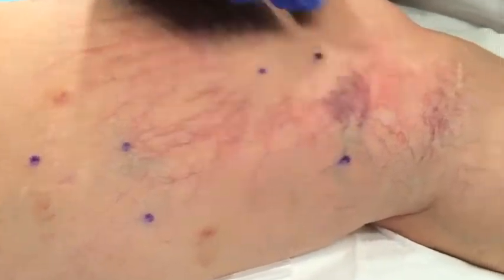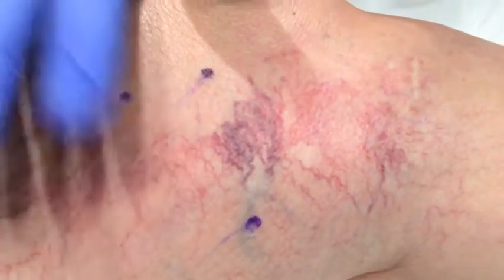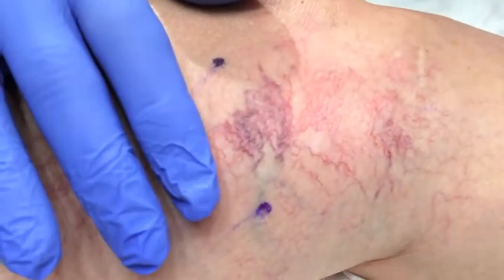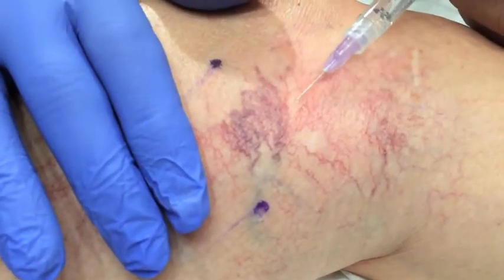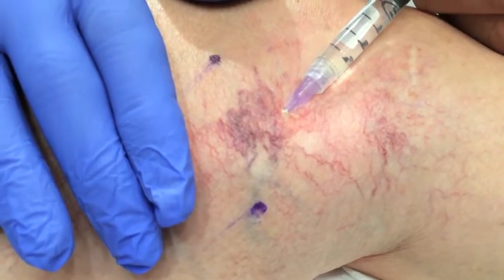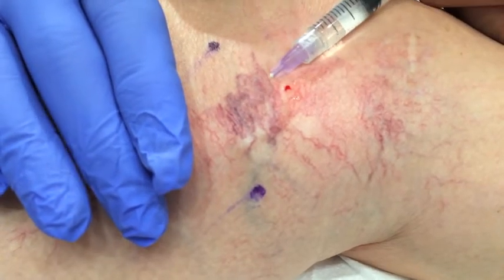She has a larger complex here that's blue — spider complex right here. Since this is going to cause a little bit more discomfort, she tolerates this without any problem. I'm going to inject a little tumescent, a little stick here, subdermally. And what that does, it just takes the edge off as we do the laser.